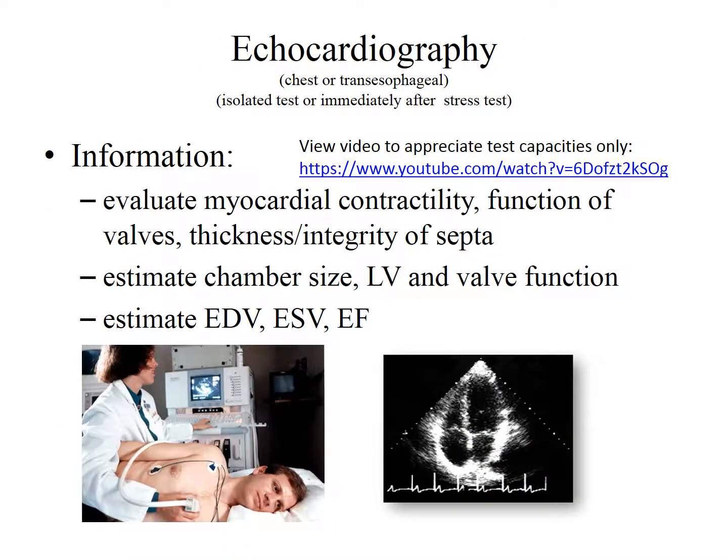Echocardiography is a non-invasive procedure that uses pulses of reflected ultrasound to evaluate the functioning heart. A transducer that houses a special crystal emits high-frequency sound waves and receives their echoes when placed on the chest of the patient. The returning echoes, reflected from the intracardiac surfaces, are displayed on ultrasonography screens, giving real-time images of the beating heart.